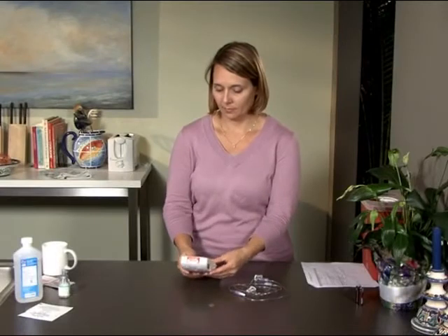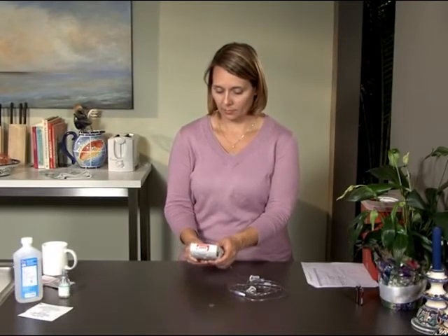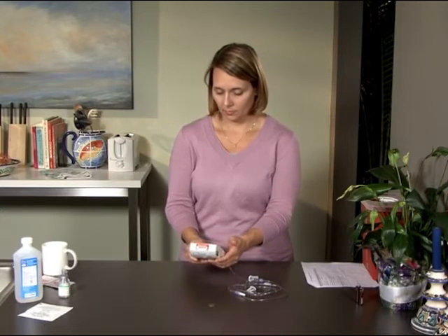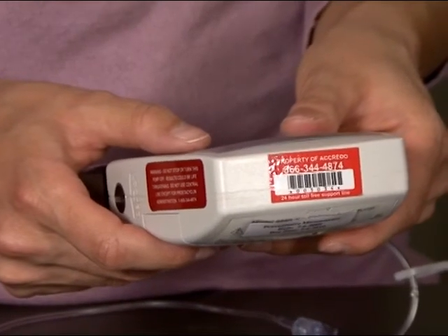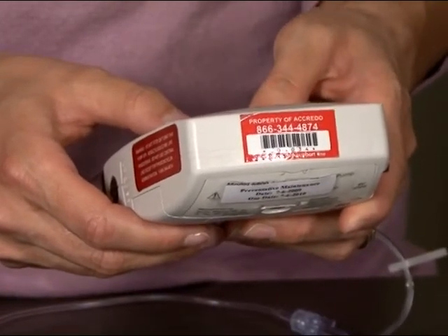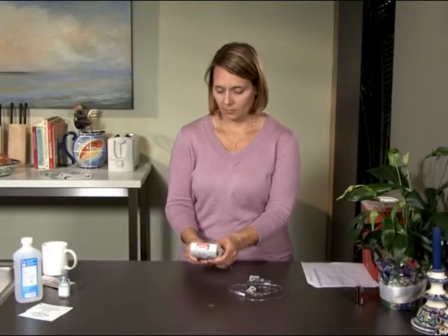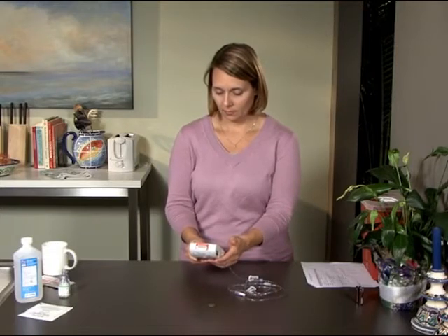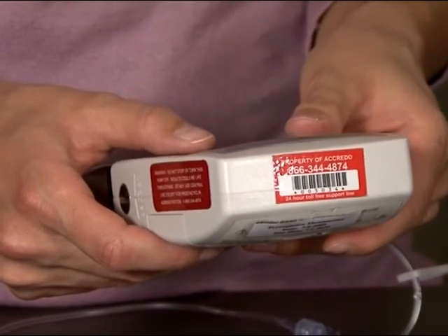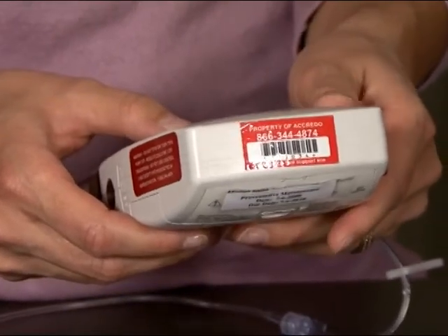Now that your pump is connected to your central intravenous line, it's time to start the infusion of medication. Press and hold the start/stop button on the pump until a series of lines appears. The pump will perform a short self-test, and then the word 'run' will appear. Press the next button to double-check that your settings are correct. Once you've checked a setting, press next to continue to the next setting. When you're through checking your settings, press the next button to return to the run screen.